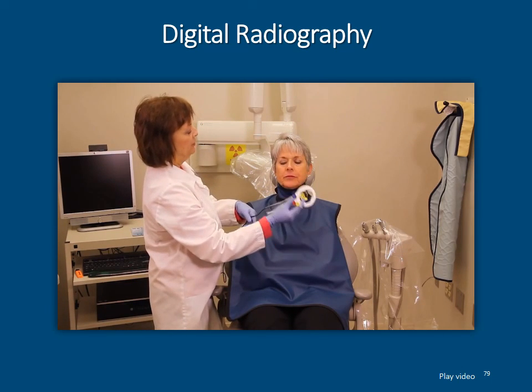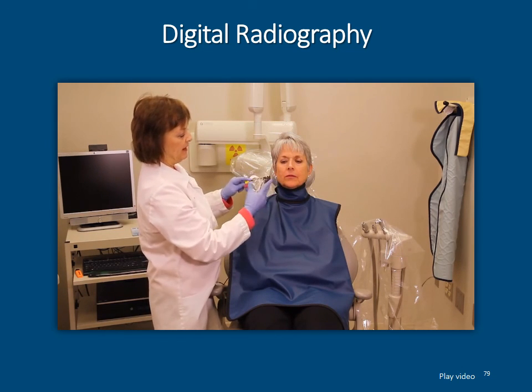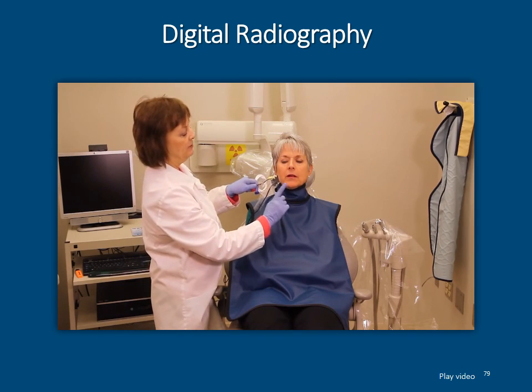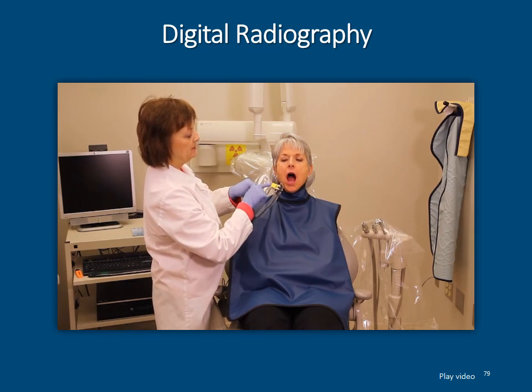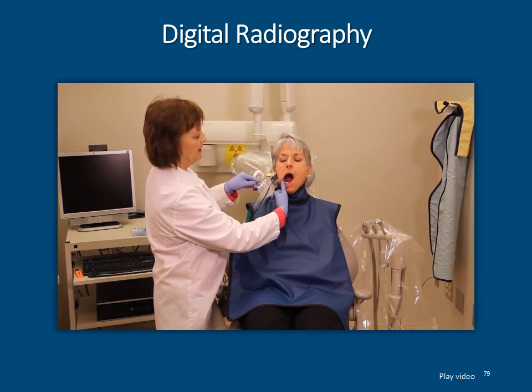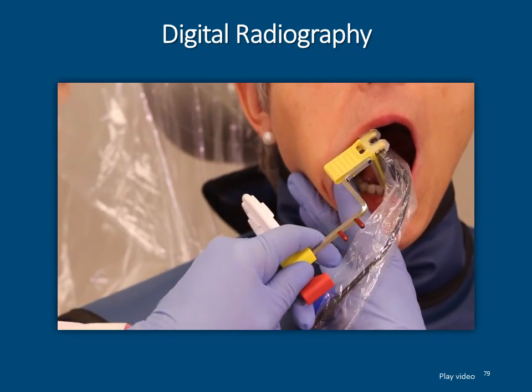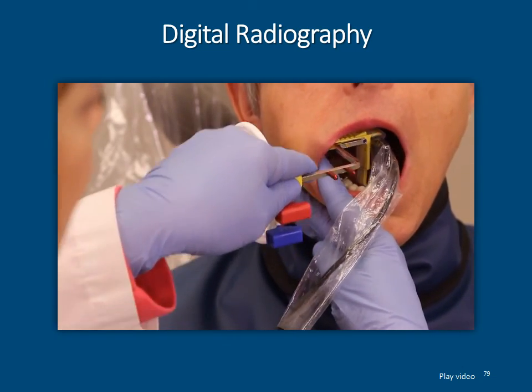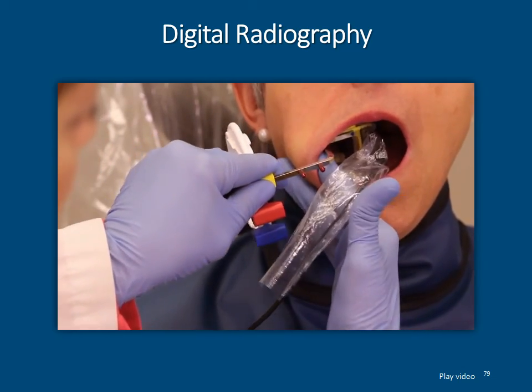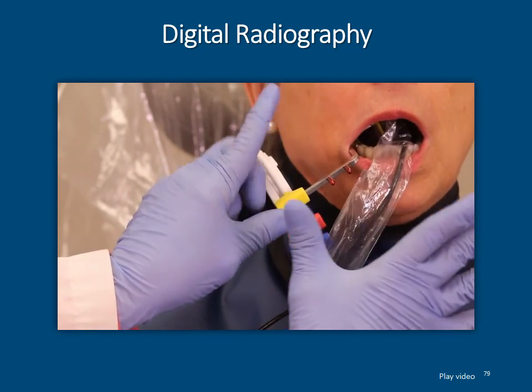The way this is put together, you can actually do the opposite quadrant right away. So what I'm going to show you is how to place it back on a lower molar. I usually hold this with my left hand and use my right index finger. This piece here must go within the cheek, so make sure you really make a nice pocket. The sensor itself has to slide right next to the teeth. So you got to stretch that cheek out, slide that sensor way back so that you're back by the molars, holding the cheek. Once you get it in there, have the patient close, let go.